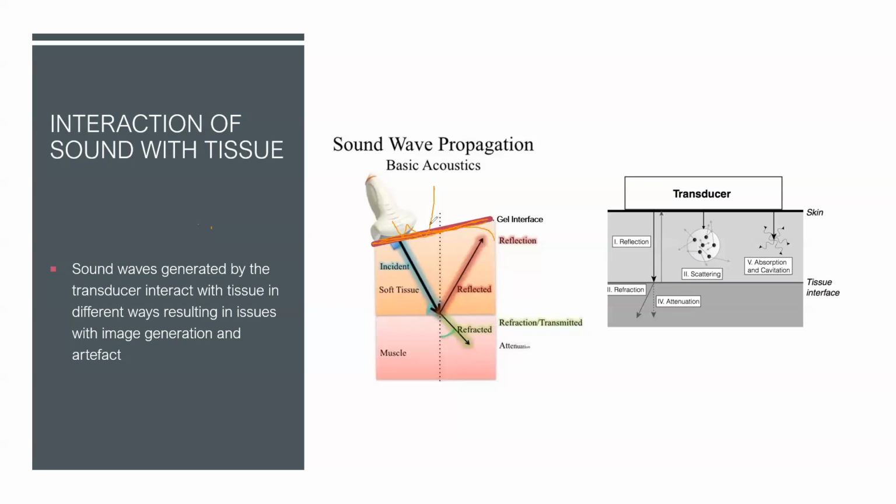But when you look at the brain, it's got sulci, gyri, it's got lots of tissue. And within the tissue, it's got a lot of material. And a lot of material within the brain tissue basically causes sound waves to scatter. And when they scatter, naturally they come back to the transducer at differing times, at differing energy levels. And that basically gives you the pattern that you see within brain tissue, or the granularity that you see within brain tissue.